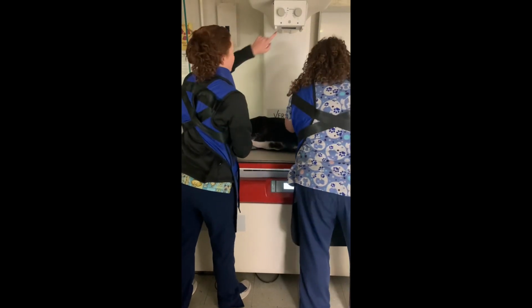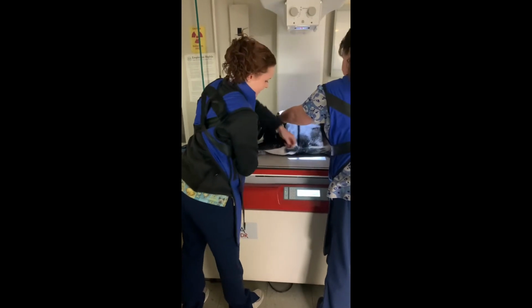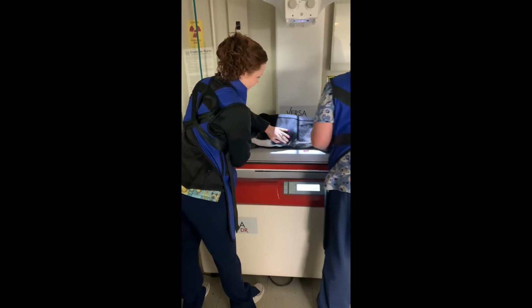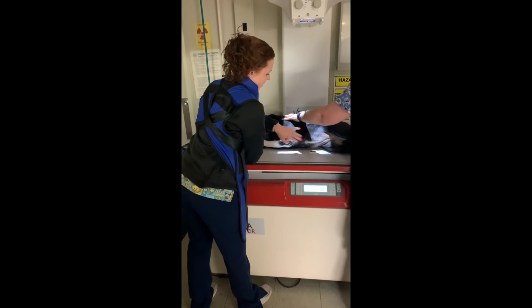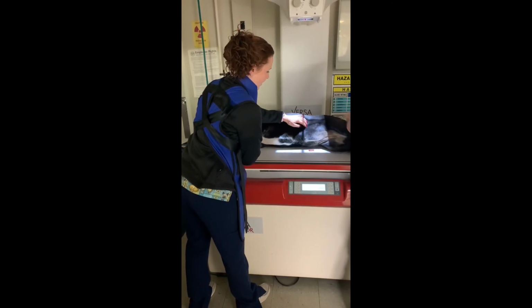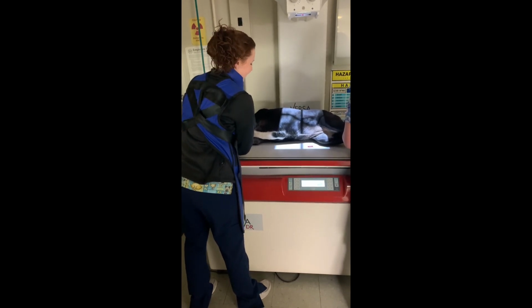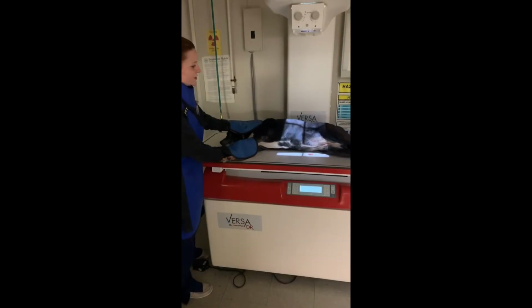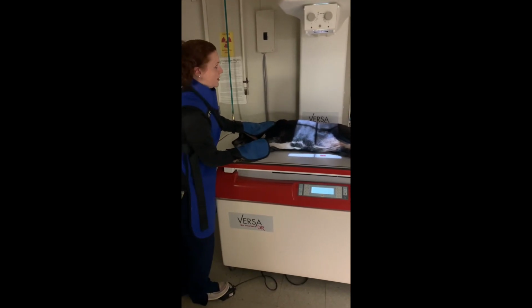Okay, it's all right, sweetie. So I'm gonna put my marker in, which are crosshairs, just in line with what would be the umbilicus. It's okay, honey. So we'll have her all set up, and we're gonna put our gloves on. So now that we have her in position and I got my gloves on, then I can take the radiograph.